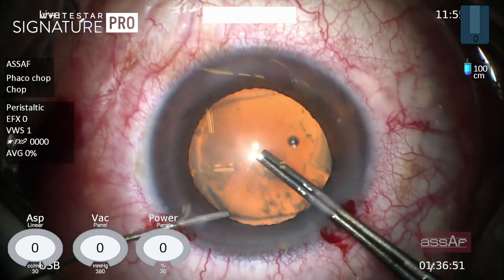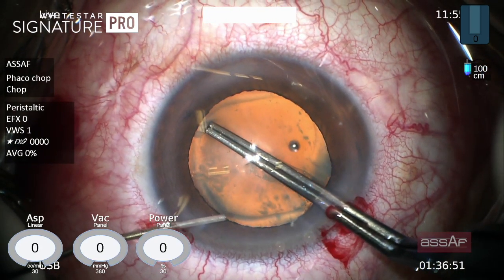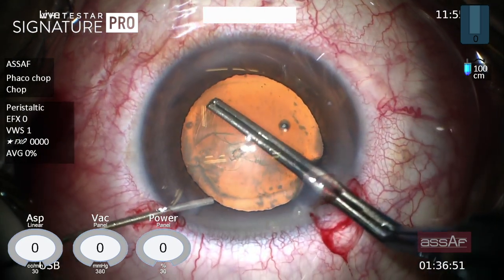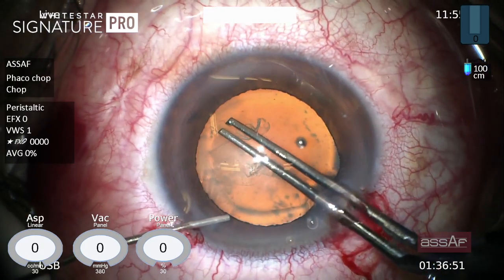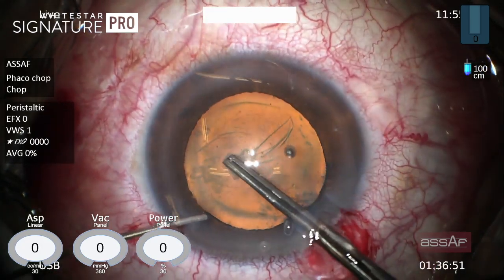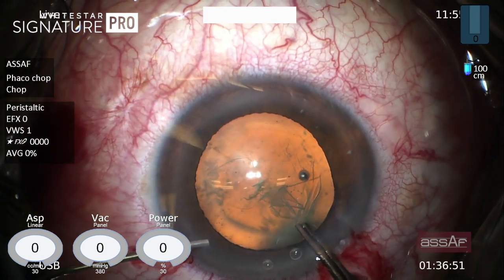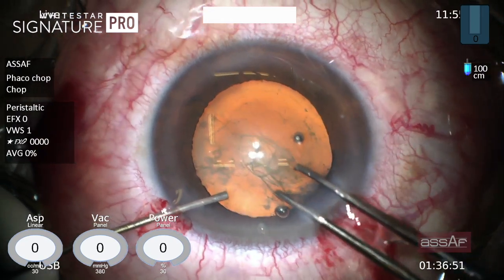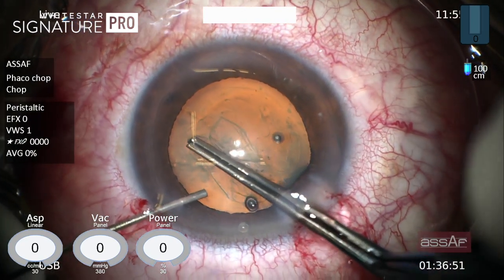Remember that post-vitrectomy eyes have a compromised posterior capsule, quite similar to posterior polar cataract eyes, yet the cataract tends to be hard and the nucleus usually larger compared with posterior polar cataract eyes. So you have to keep the rhexis large enough to allow for safe emulsification of the hard nucleus, yet also allow for safe implantation of a three-piece lens in the sulcus with optic capture in case of posterior capsule rupture.